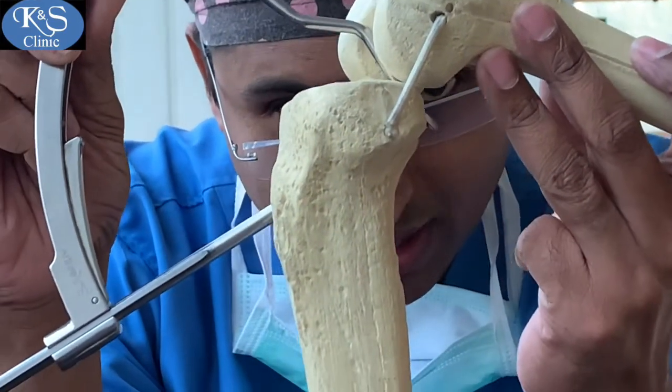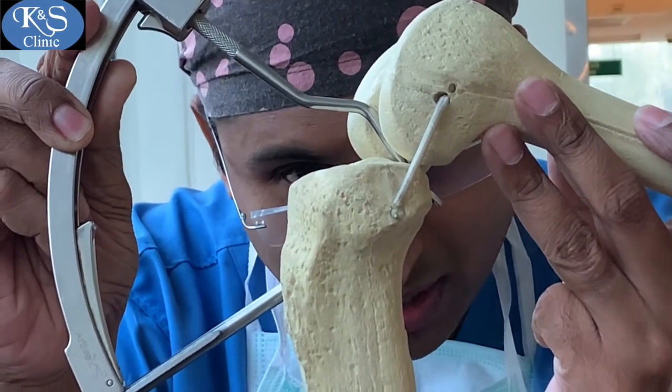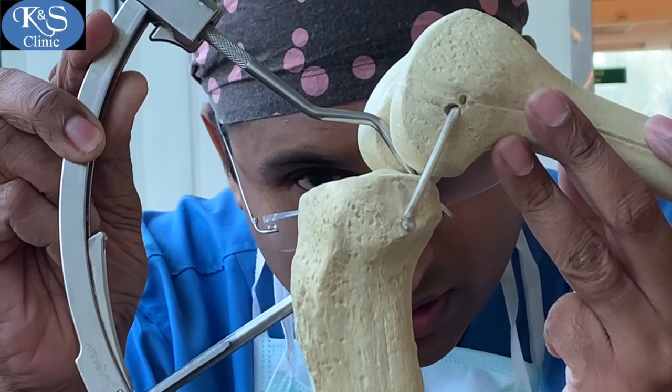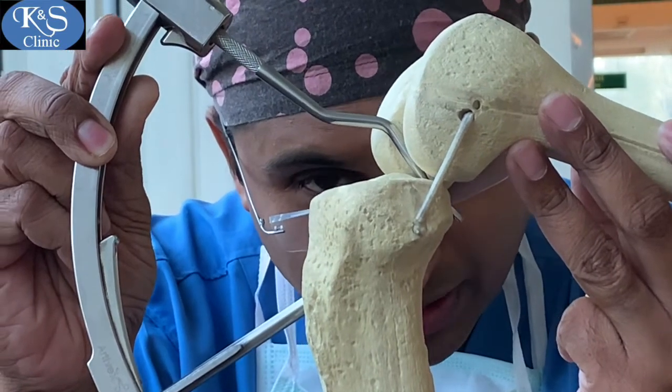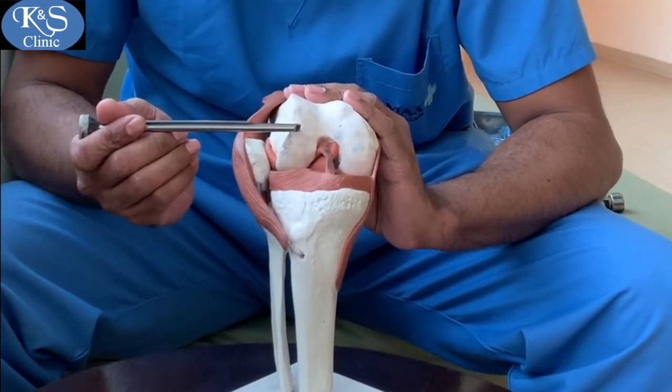From here a guide wire comes out, which is then over-drilled with the graft diameter drill bit. Drilling at the femoral footprint involves making a high anterolateral portal to view the medial aspect of the notch.